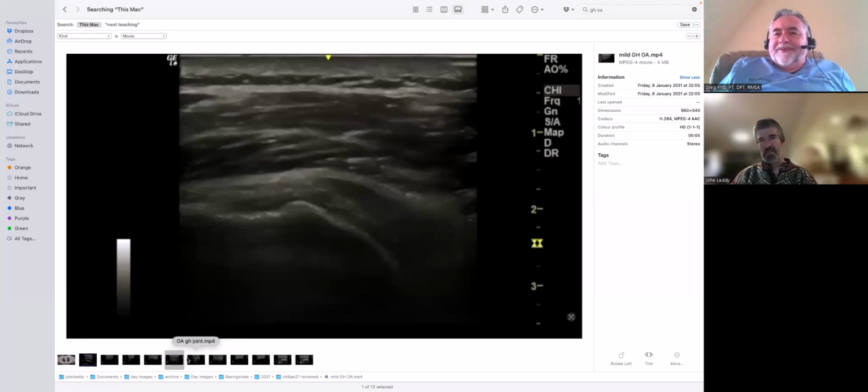I just eyeball it and say, I think that's thickened or not thickened, and how I feel about it is evolving. But yes, that was why I started looking, because I wanted to have a look at the capsule and make some sort of reliable thing with the frozen shoulders.